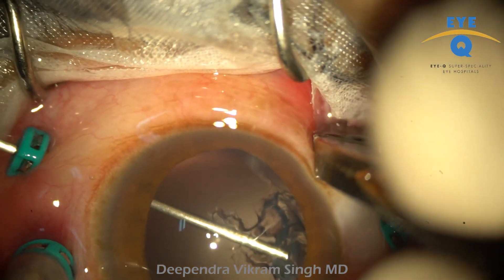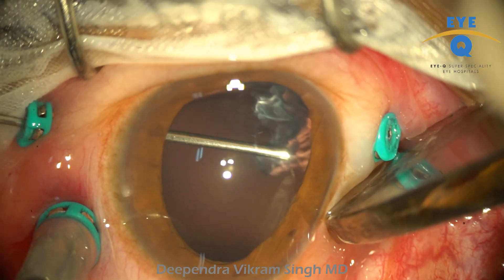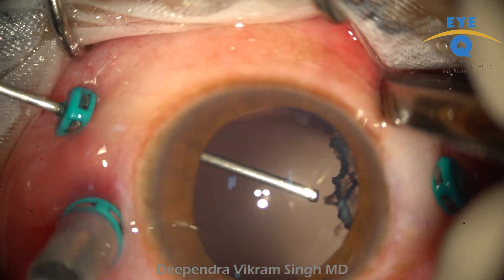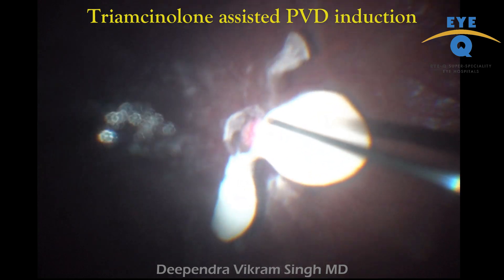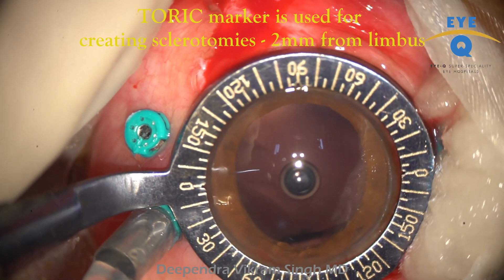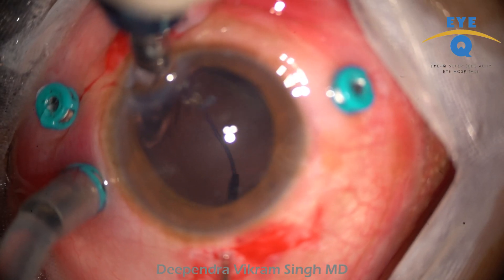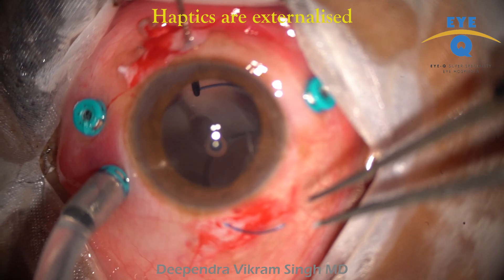Lensectomy was followed by PVD induction with the conventional technique. Limited conjunctival peritomy is performed at diagonally opposite clock hours. A toric marker is now used to mark the sclerotomy sites. The three-piece IOL is injected and both haptics are externalized one by one with the conventional technique.